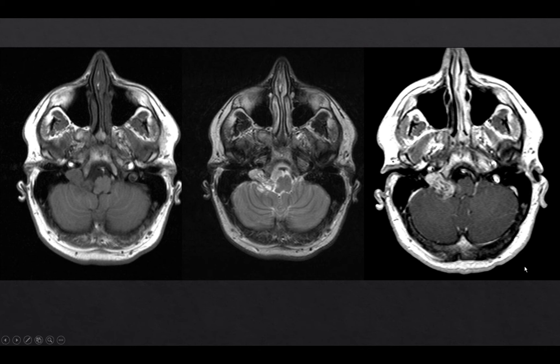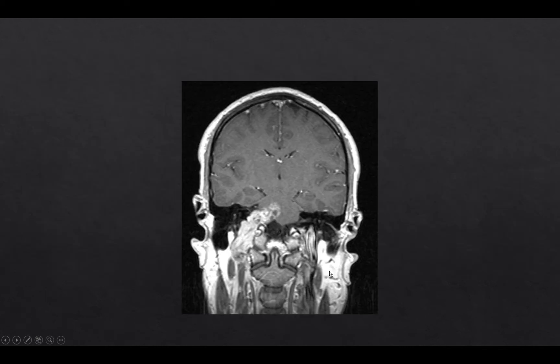The mass has a few non-enhancing sites which are hyperintense on T2. The mass displaces the medulla to the left, and the growth pattern is best seen on the coronal image. There is a superomedial growth pattern coursing along the expected location of cranial nerves 9, 10, and 11. This is most consistent with a nerve sheath tumor such as a schwannoma — and this indeed is a schwannoma.